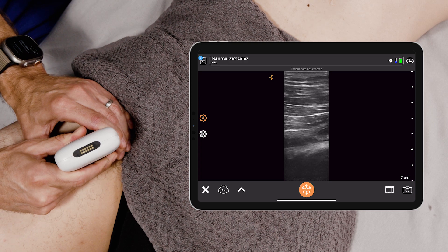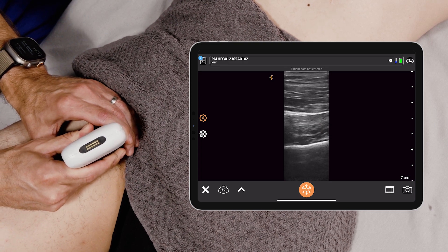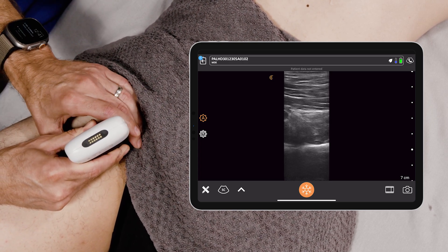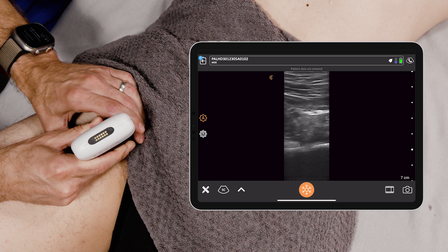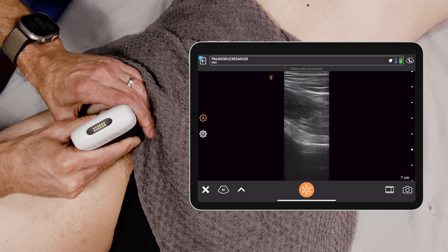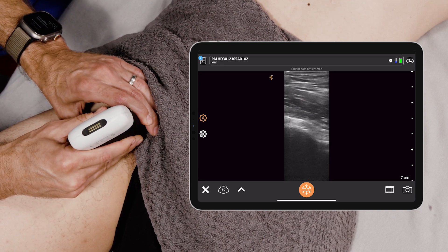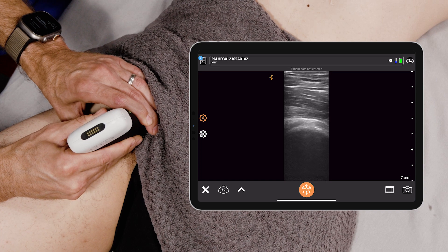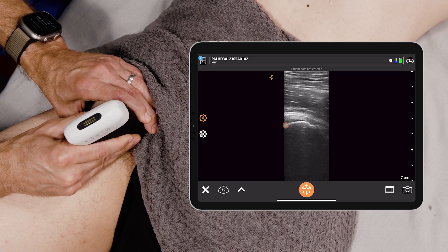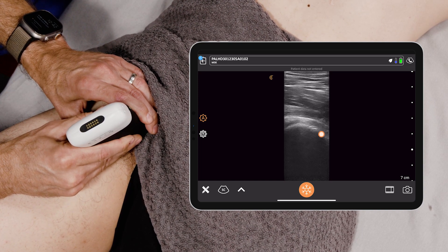Now you want to just track proximal and follow that femur up, up, up until you're hitting basically the femoral neck and then the acetabulum. And that is your joint space.